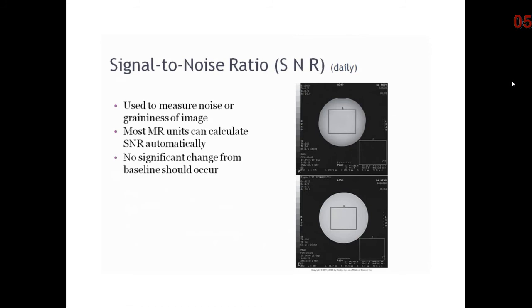Signal-to-noise ratio is simply the signal intensity of the image compared to the noise level in the image and expressed as a ratio. There are several factors that can decrease an MRI scanner's SNR, which includes a change of resonant frequency, a break in RF shielding, changes in scanning parameters, a fluctuation in the magnetic field strength, decreased RF coil performance, and change in the general system calibration.